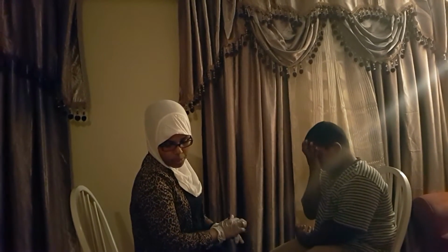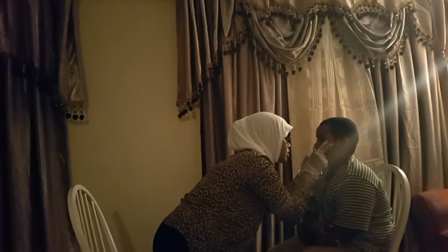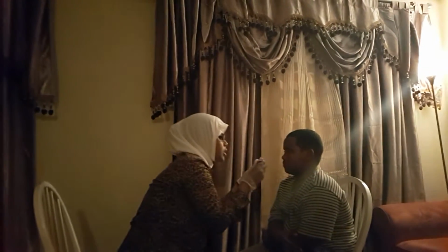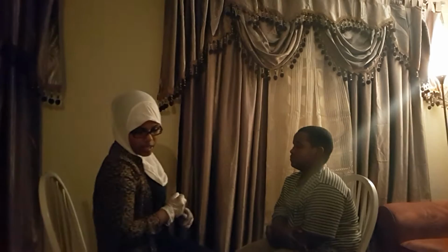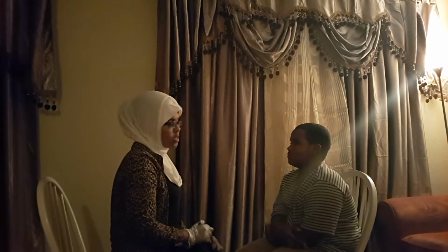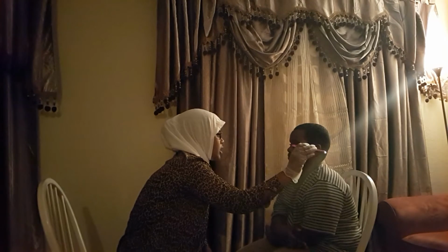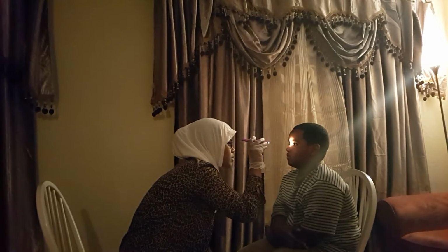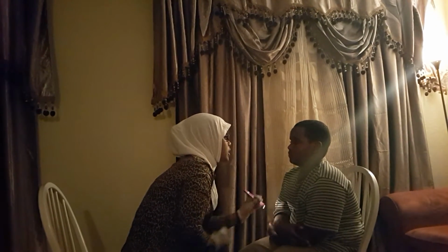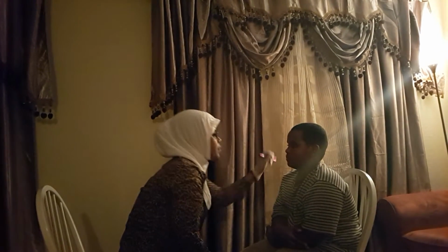And pupils now. Let me see what size your pupils are. Okay. Your pupils look like 3 mm in size, and the shape is round. As far as reaction to light goes, I'm going to look for direct light reflex and consensual light reflex of the iris. Alright, direct. Consensual light reflex. Alright, on the other side. And consensual. Alright, looks good.